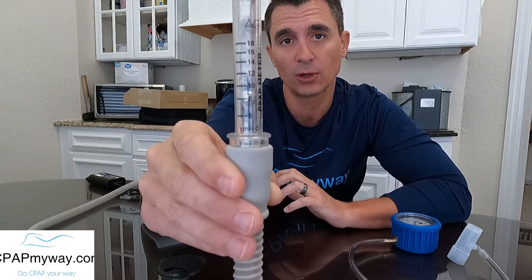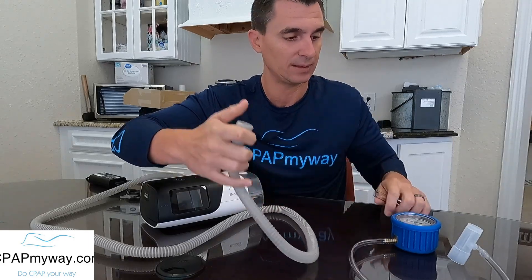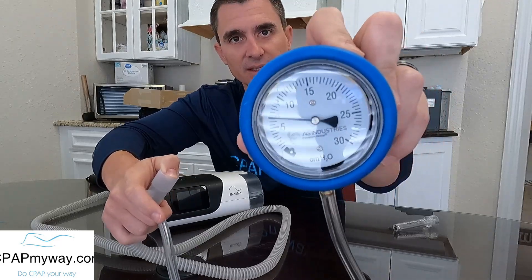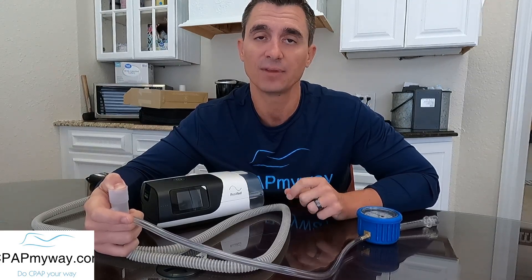Before you take a pressure gauge to the machine to determine your accurate CPAP pressure, you need to have the EPR turned off, or just account for it mentally. On the bigger manometer you can see it blowing right at seven centimeters — because the CPAP is set at 10, EPR is set at three, putting the gauge at seven centimeters, which is what the machine thinks you need to exhale against. Keep that in mind: make sure your EPR, Flex, ResLex, or whatever setting you have is turned off when you take the gauge reading.